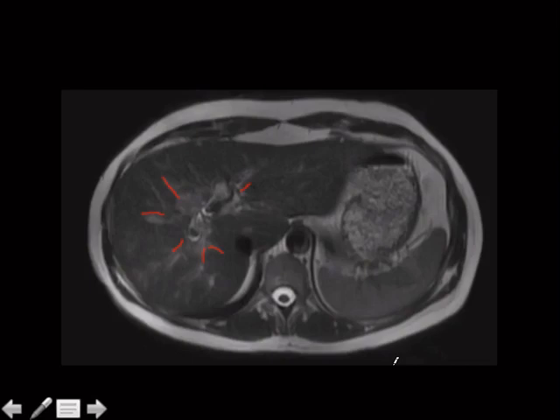I was like, why do you have periportal edema? So on a single cut only through the liver with no other explanation, you need to think about hepatitis. An enlarged liver also, and the other way that they like to show hepatitis, classically in case conference, and very likely on multiple choice tests, is that thickened gallbladder wall. The gallbladder edema. Just think about the liver having a lot of edema and being swollen while it's dealing with its itis.